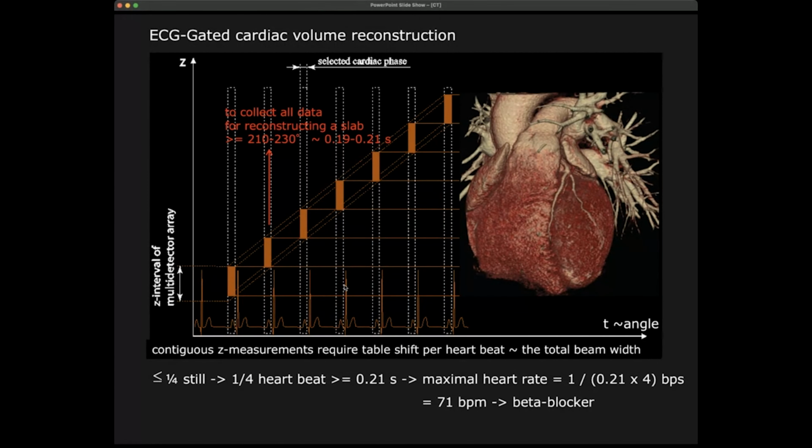On the contrary, with ultrasound imaging, we can really go real time. So there we really can acquire the whole heartbeat within one cardiac cycle, knowing that it comes from one cardiac cycle.